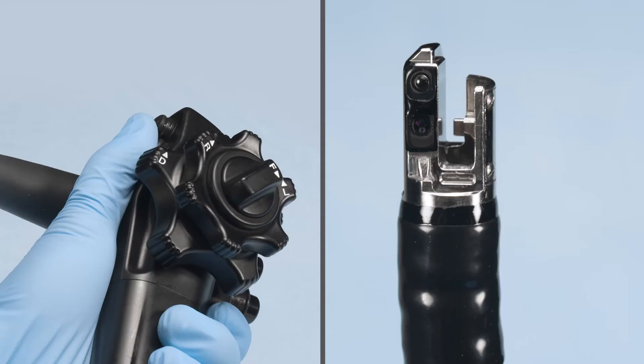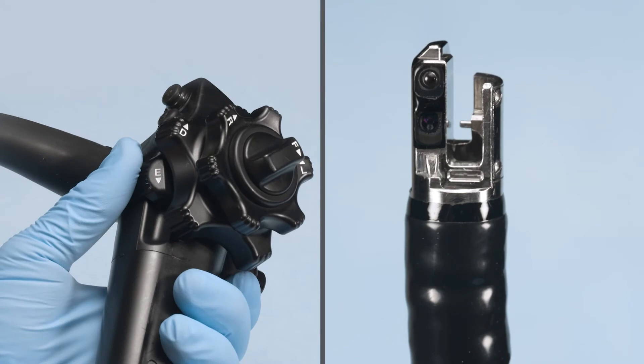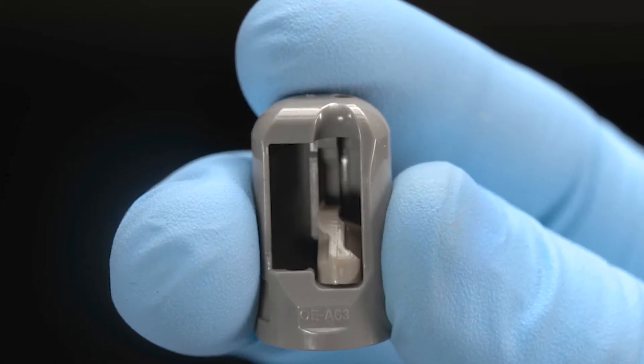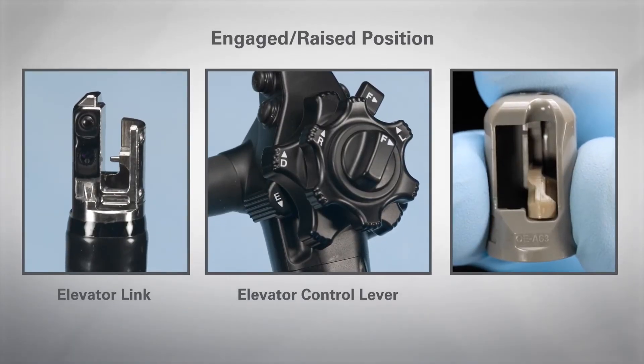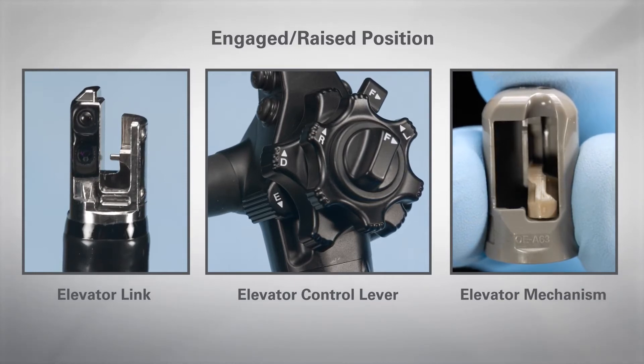In the engaged or raised position, the elevator control lever is pushed distally until it stops. The elevator link of the endoscope will be perpendicular to the objective lens, and the elevator mechanism of the elevator cap will be perpendicular to the opening. Here you can see the elevator control lever, elevator link, and elevator mechanism all in the engaged or raised position.